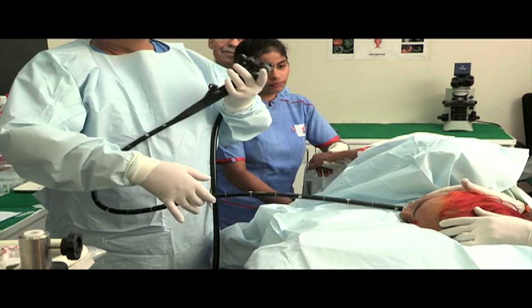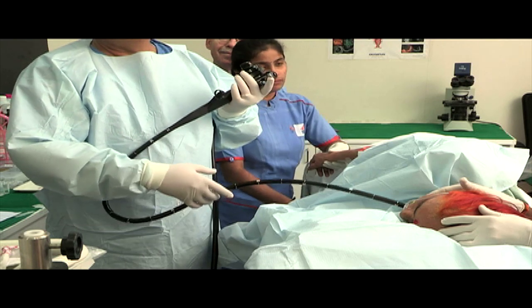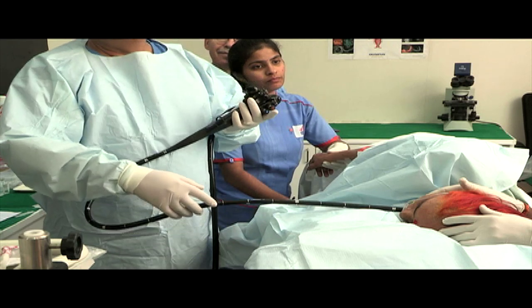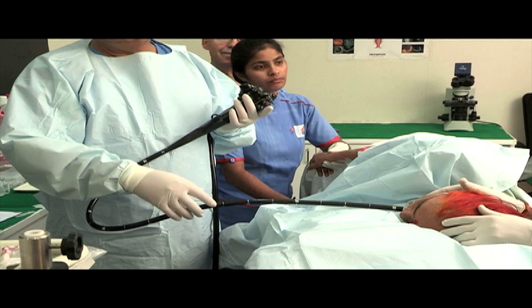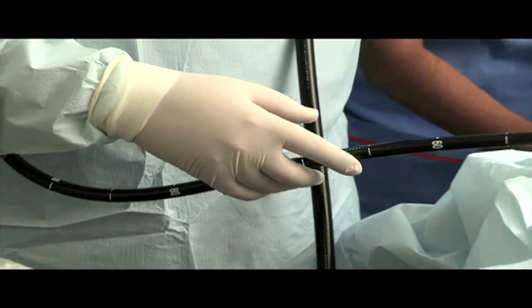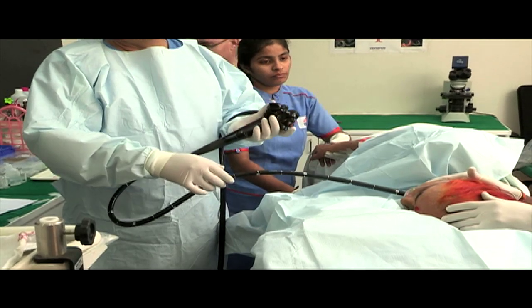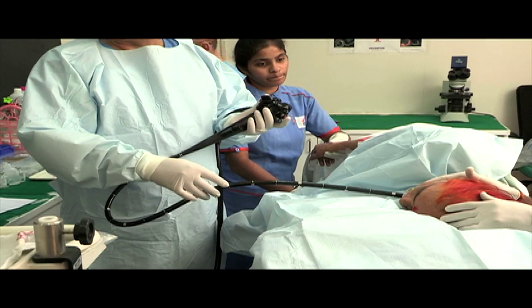The left hand holds the control section, which literally rests over the left hand. The right hand controls the shaft farther away from the mouth of the patient. Torque or rotatory movements are produced by rotating the left hand and using the right hand as a fulcrum.